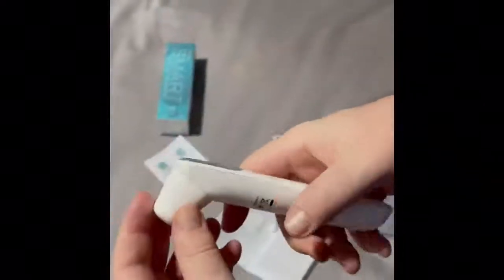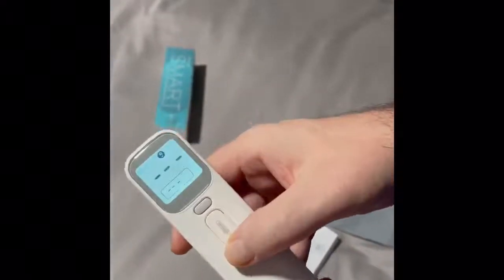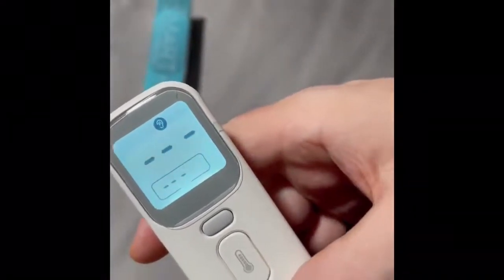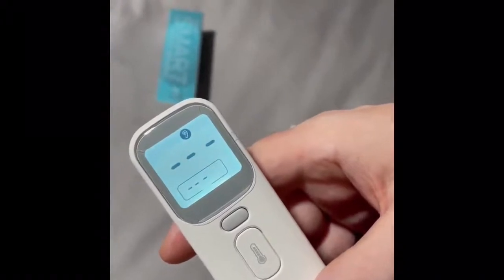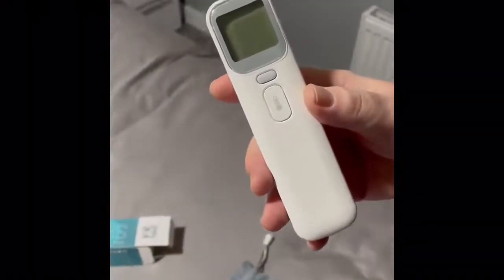Right, I'm going to remove the magnetized section now, which takes the temperature with the ear, push the power button, and it automatically comes on to the LCD display that's displaying the ear, so you know it's ready to take the temperature from the ear. So what I'll do now is I'll give it a test. Now I'll show you all the symbols and which section does what. So now I'm going to just do my test and see how it works.